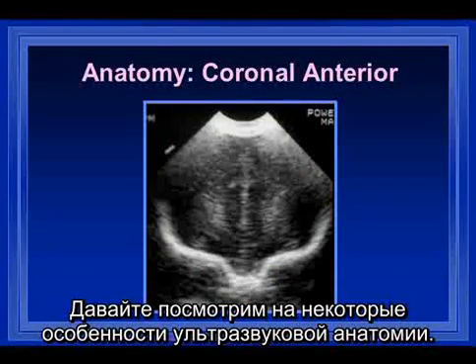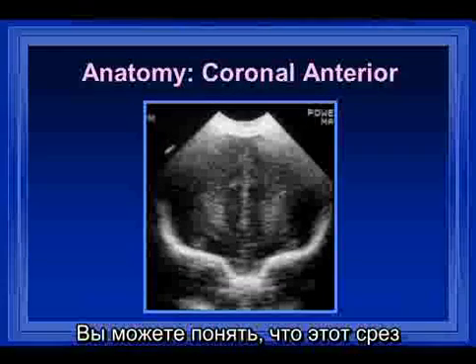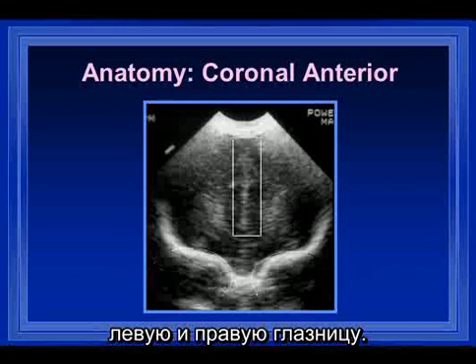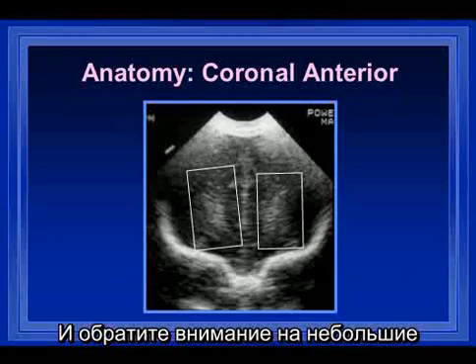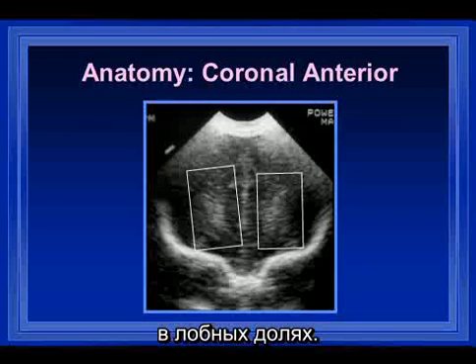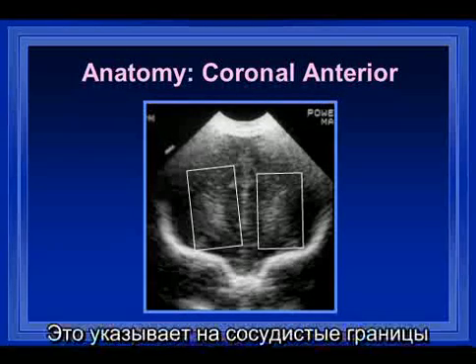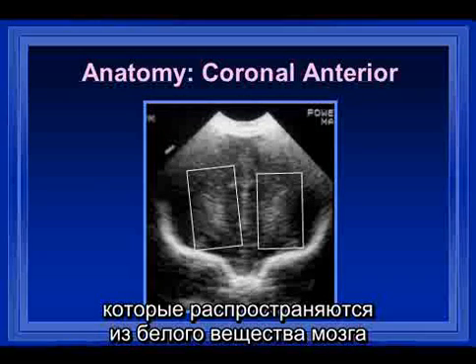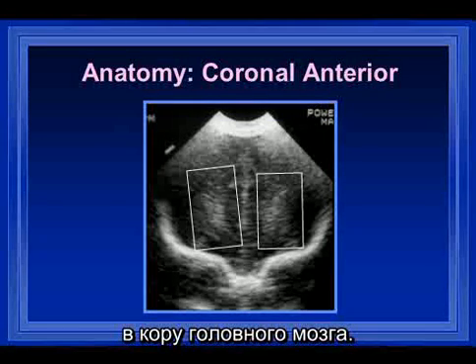Looking at ultrasound anatomy, this is a very far anterior view — you can identify it because you can see the left and right orbits. The interhemispheric fissure is seen here. Note the little areas of brighter echogenicity in the frontal lobes. This is referred to as the periventricular blush. It represents vascular markings as well as neurons as they extend from the deep white matter to the cortex of the brain.